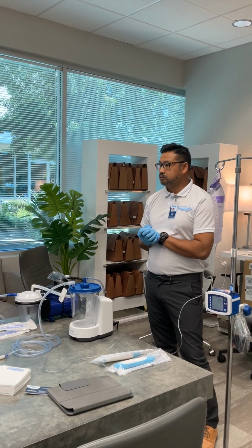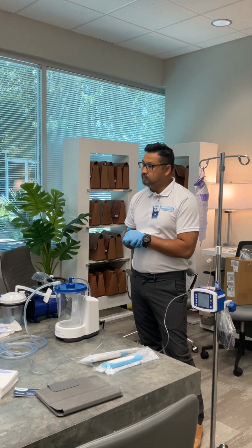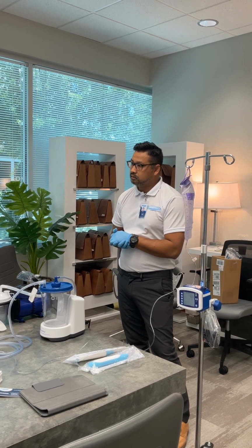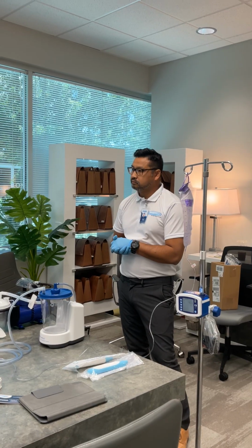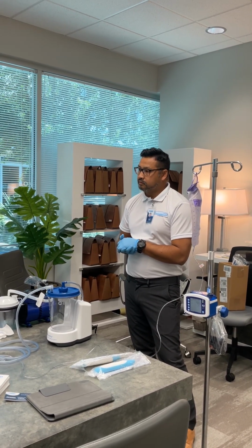So as far as ordering, if someone just says, okay, go in the portal and order this, I have to put all the information in a comment for you guys to know. You need to know the prescription, the amount, the rate, all that stuff. IV pole, syringe.